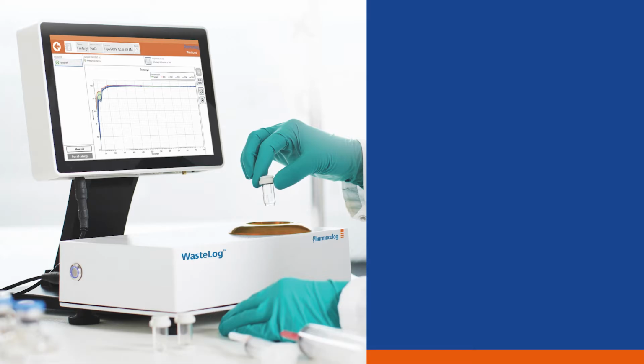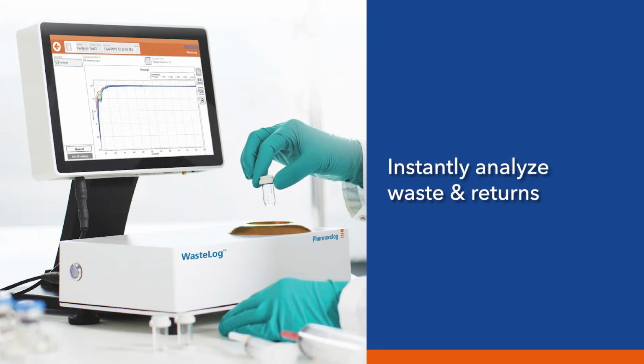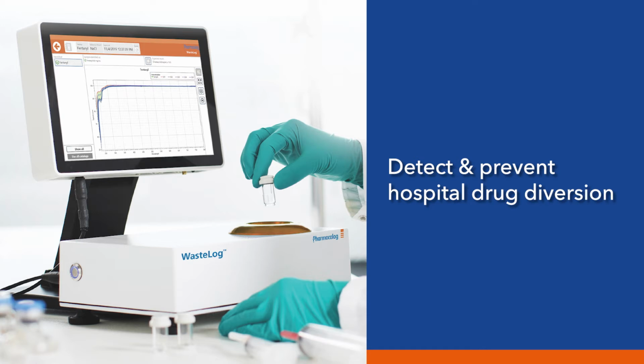WasteLog is a key component of an effective drug diversion prevention program. Used as part of the waste workflow, it instantly analyzes waste and returns. In this video, you will learn how it can help your hospital detect and deter drug diversion.